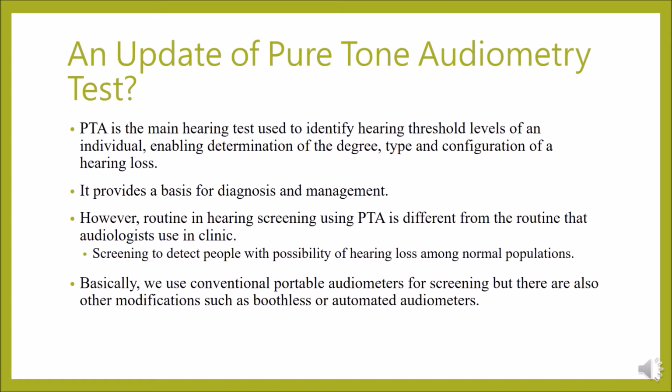Basically, we use conventional portable audiometers for screening, but there are also other modifications such as boothless or automated audiometers, which will be shown in the next few slides.